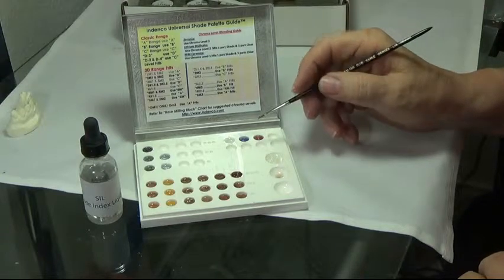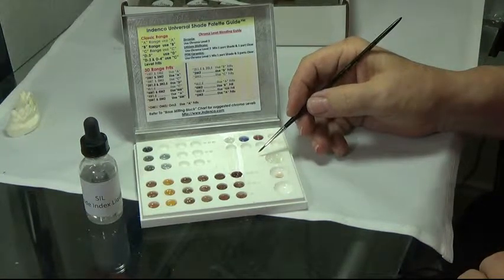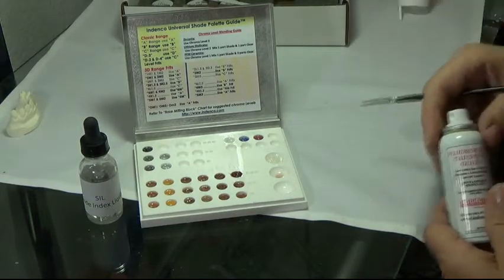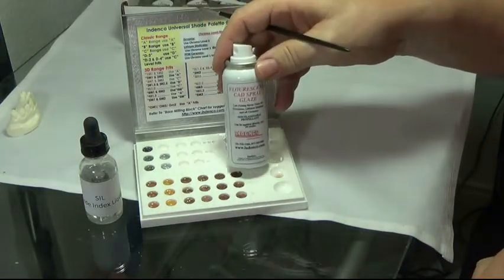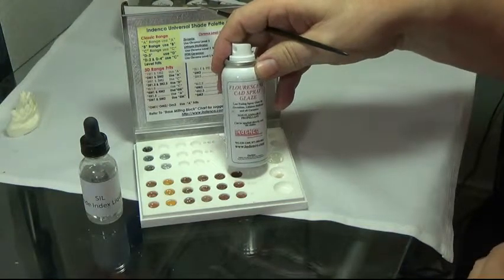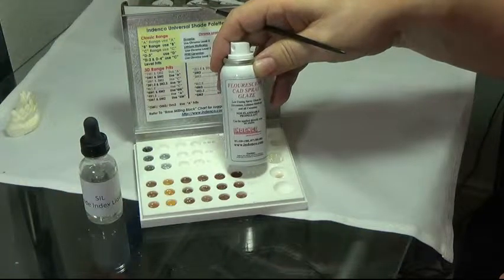What I would like to show you now is how we actually apply the shading materials, glaze them, and we will be using this fluorescent spray finish glaze on top of our Fritz palettes as an added benefit to the lifelike effects that you can get using your Indenko kit. This is an option and I am going to show you how to use this in addition with your palette.